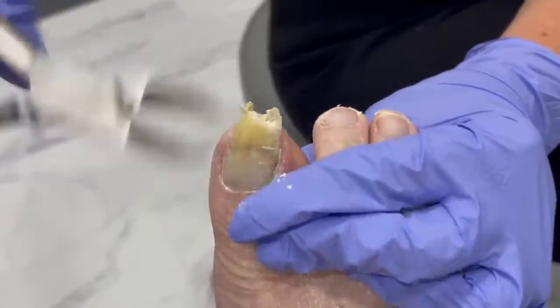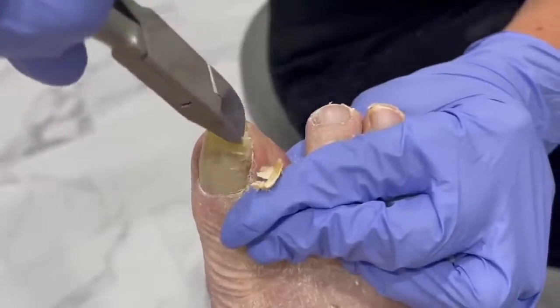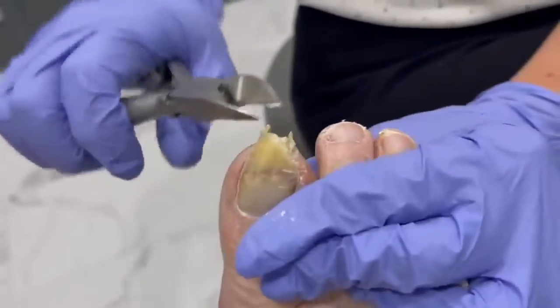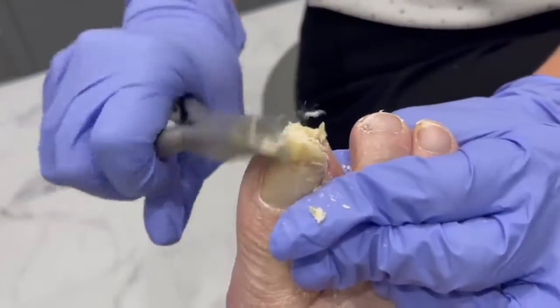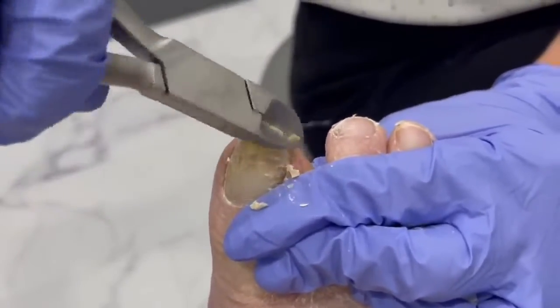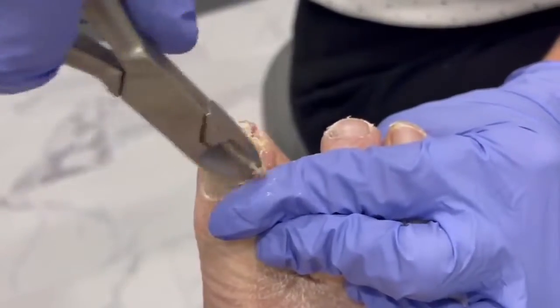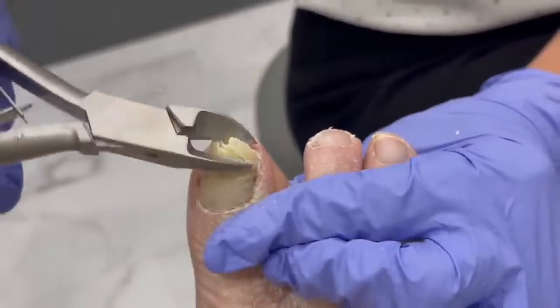This is another good one. It's not loose like the other one, so it'll be completely different. I really hope the sound is transferring — it just crumbles beneath the nippers. This may be the most fun thing I do today, but you didn't think that, did you?